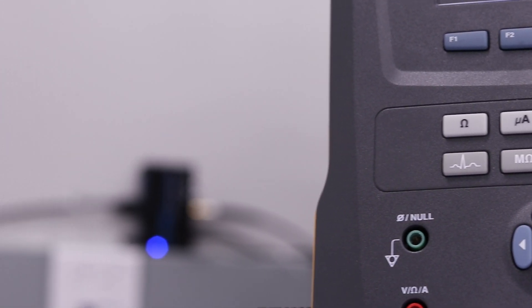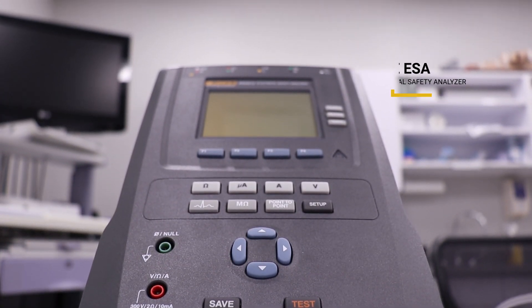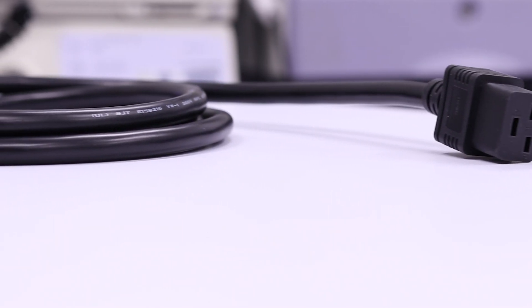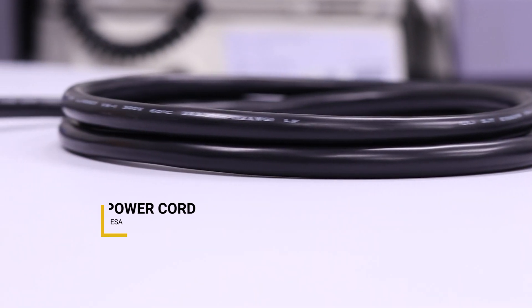Electrosurgical generators, like the GI-4000, often require periodic electrical safety testing to verify the device is compliant with industry standard safety specifications. Let's look at all the equipment we will need to perform electrical safety testing for the GI-4000.